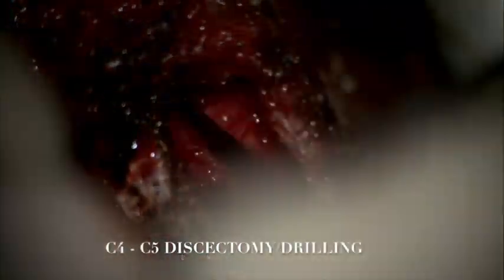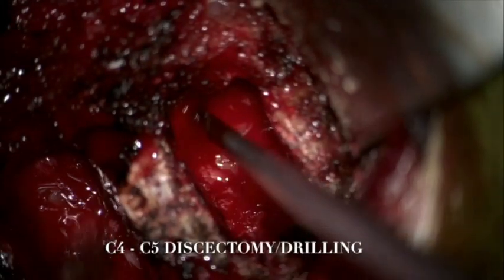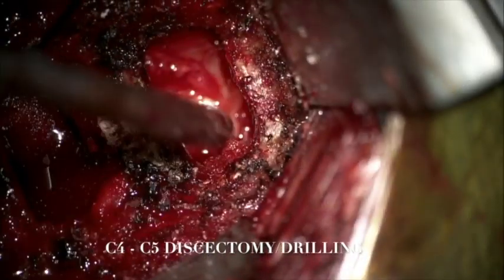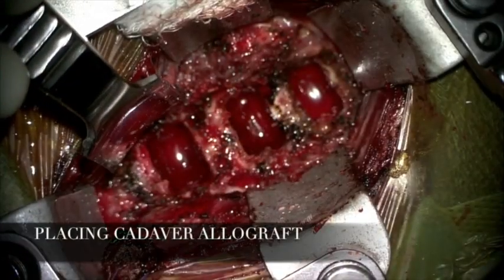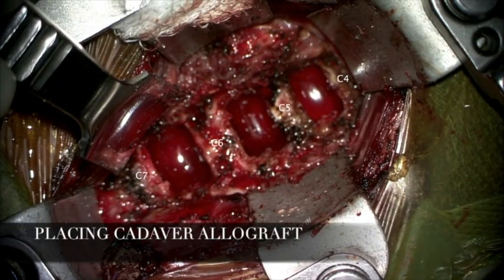Again at this level, good decompression was achieved, removing the soft disc material and the disc osteophytes. Note the rectangular shape of the intervertebral disc space prepared for allografts and the flattened anterior surfaces of the vertebral bodies.